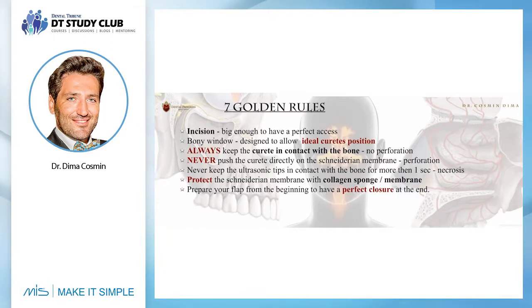Otherwise, if you press it on the membrane, you will perforate it. So never push the curette directly on the Schneiderian membrane, because you will perforate it. Just keep it in contact with the bone and roll easy to detach it from the bone.